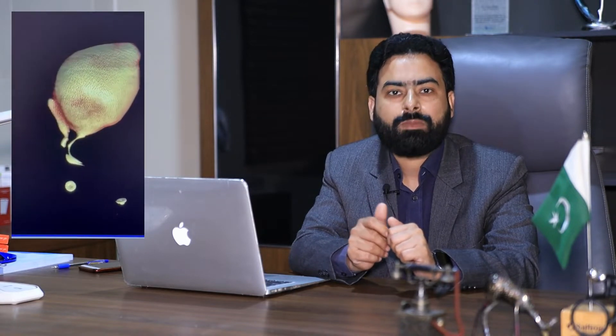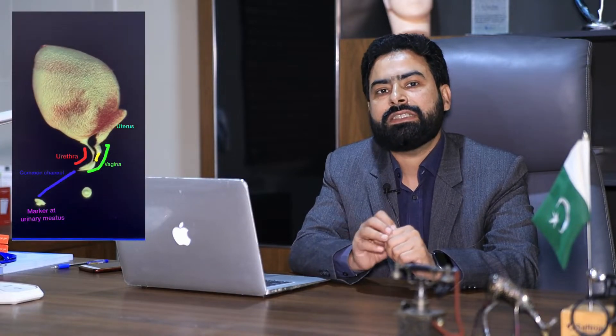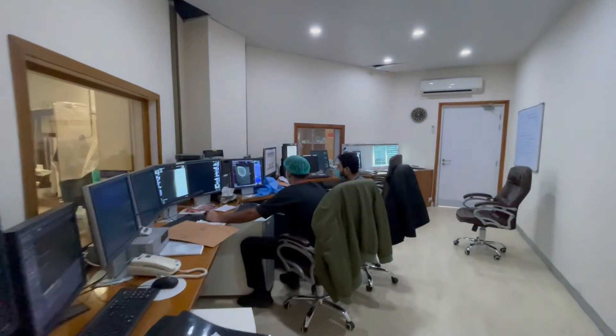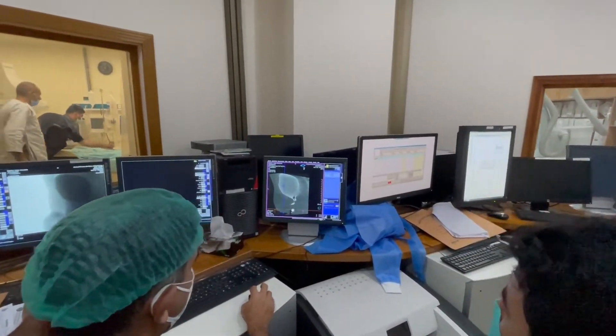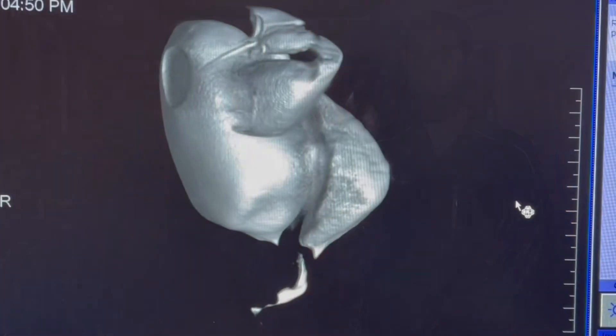Then on the very next day, we usually perform the 3D cloacal or sinogram, and this really helps us to see the internal structures in a 3D way. This study requires a multidisciplinary team approach involving an interventional radiologist, a team of surgeons, anesthesia people and a trained support staff. Keeping in view the complex nature of the anomaly, we need to have a comprehensive plan before execution to achieve near perfect results. The 3D reconstructed sinogram or cloacal gram gives us the base to build our plan for surgery.